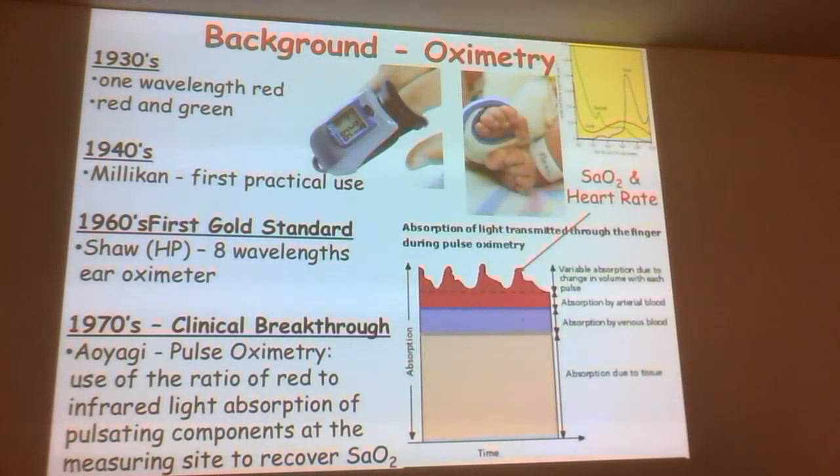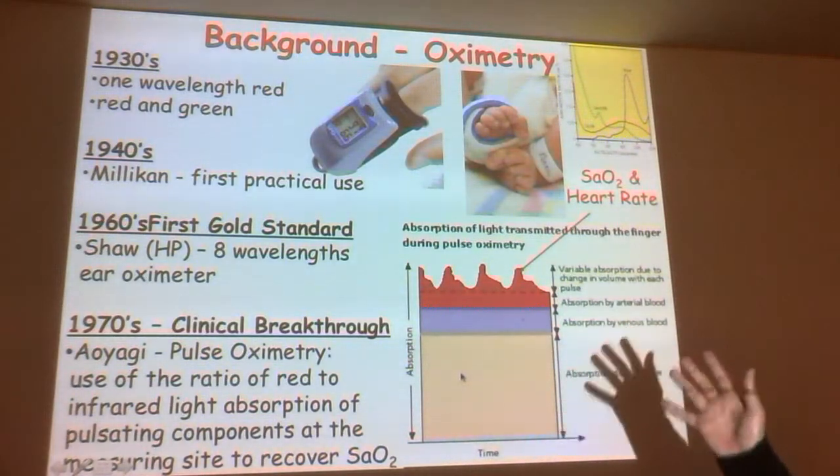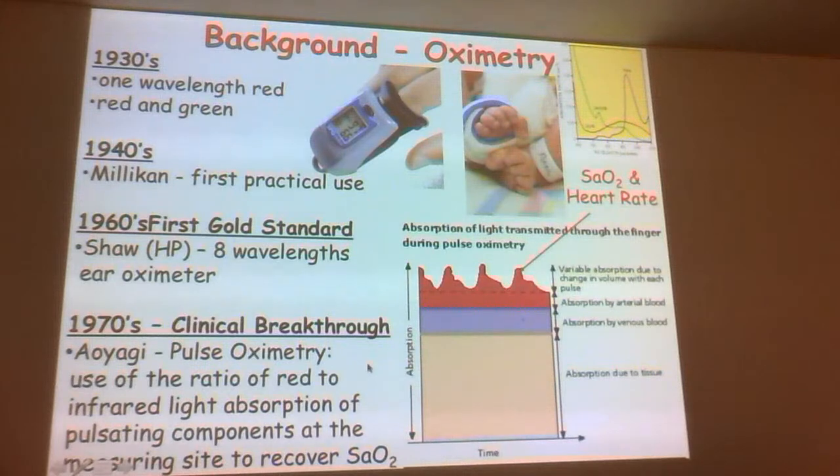But pulse oximetry actually introduces this pulsatility onto the absorption coefficient. It's pulsating the amount of blood in the tissue, which pulsates the amount of hemoglobin, which then pulsates the amount of light we detect. And just through some clever algebra we could do tonight after some beers, you can actually calibrate out that path length effect and retain the hemoglobin oxygenation. So this is the basis, really, of everything I do, this hemoglobin spectroscopy. But what NIRS does is solve that problem of what is that wavelength-dependent path length of light through tissue.